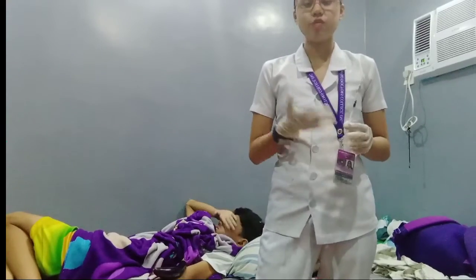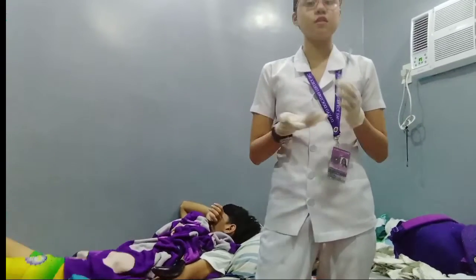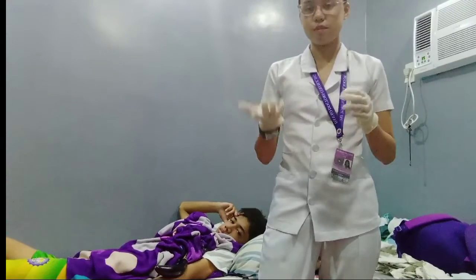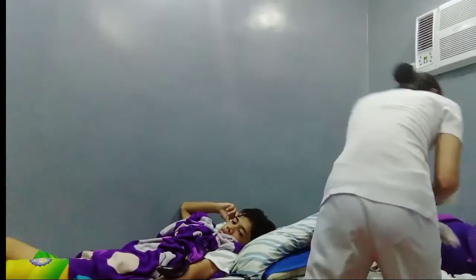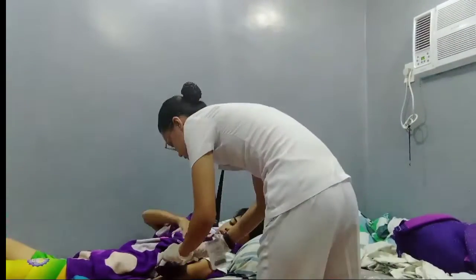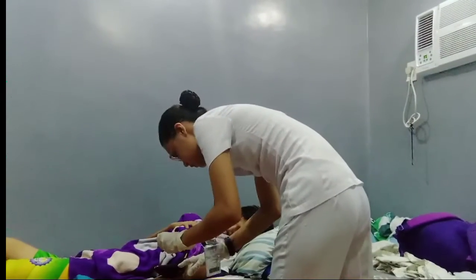Slowly inject the medication and feel the resistance until you see a bleb that resembles a mosquito bite appear on the patient's skin. If it does appear, it means that all the solution is in the intradermal tissue. Okay. Before that, again, we need to clean the injection site in a circular motion. Okay, inserting the needle.